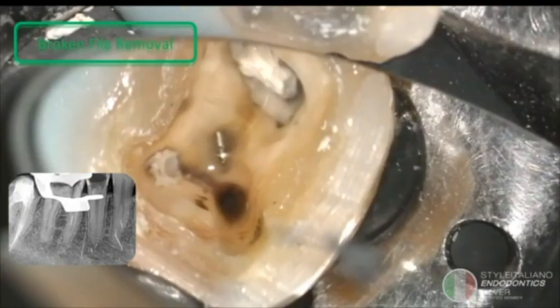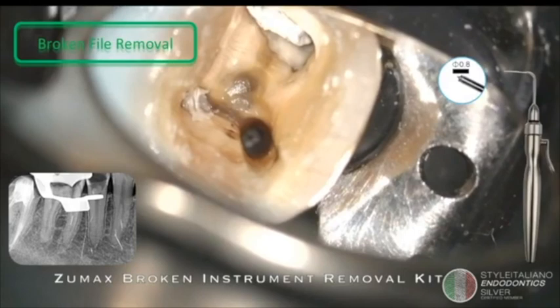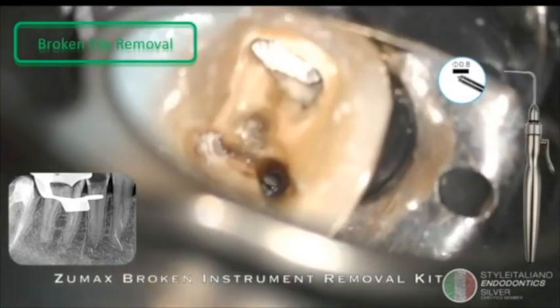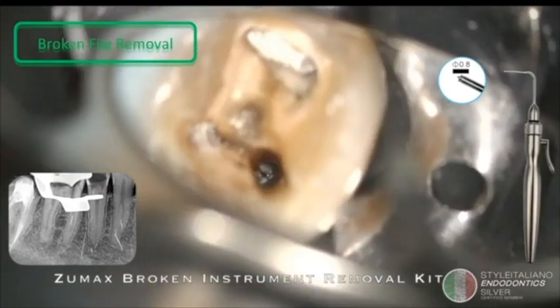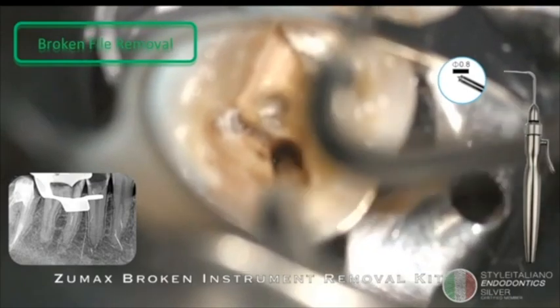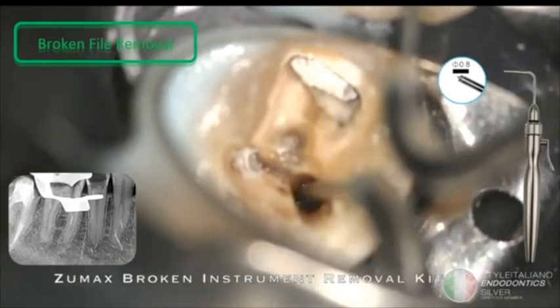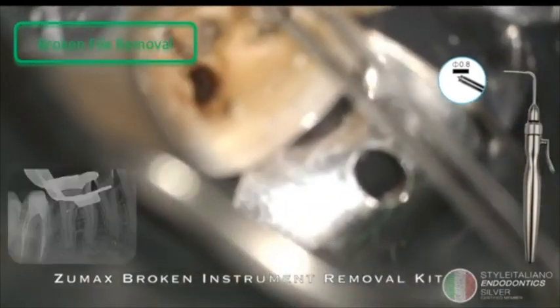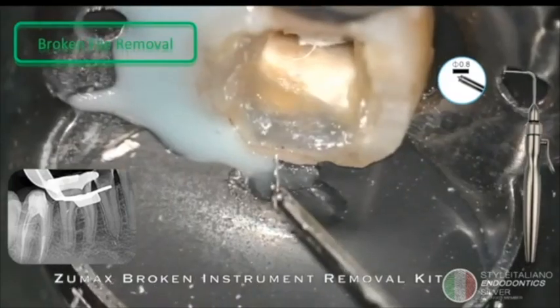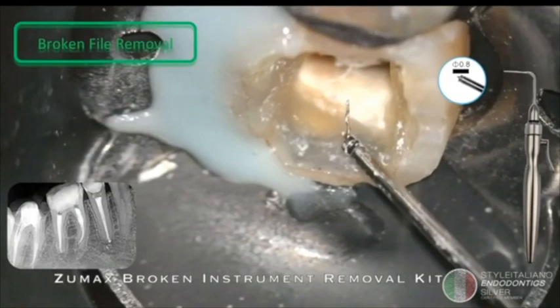I still have my main broken file in the canal. After making space around it, around 2 millimeters, I know the file is isolated in the canal and it's centered. So here I can easily take the extractor and it fits perfectly into the canal to the instrument. And I'm going to grab it and retrieve. This is the retrieval of the file with the Zumax retrieval kit. Very, very efficient.